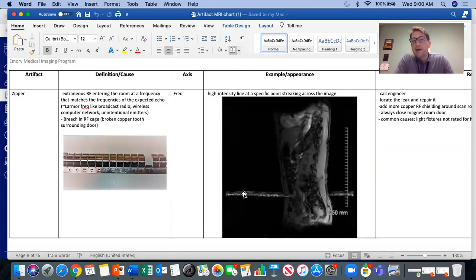So think if you have a patient come down from the floor and you switch them over to MRI safe or MRI conditional EKG leads, but at the same time you didn't take the EKG leads from the floor off, and you just left them on and they're sitting on their bed in zone 3.